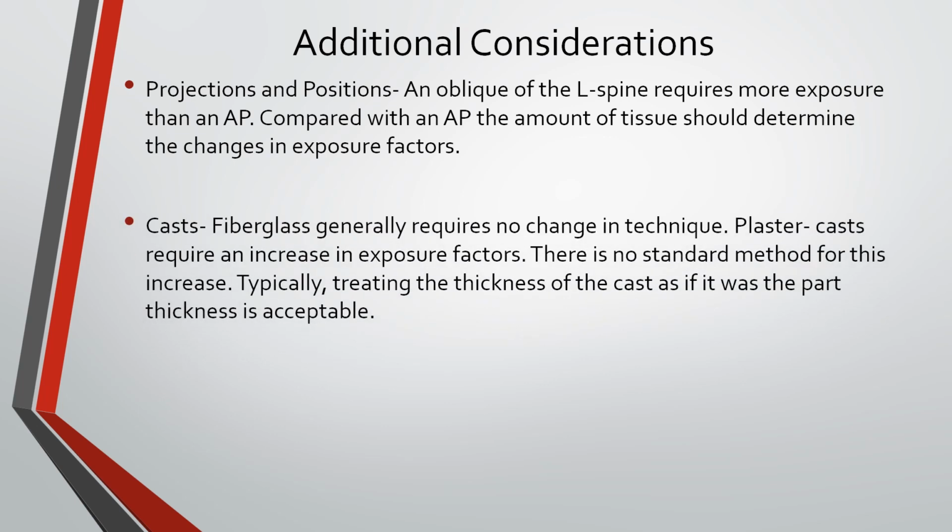So whichever position the patient is in, it's going to change what we're doing. We may change the kVp on this. If we're using fixed or AEC, the automatic exposure control, it's going to shoot higher on its own. We need to make sure that we're positioning correctly. But if we're using fixed, we need to be aware of what position the patient's in or the projection that we're doing.